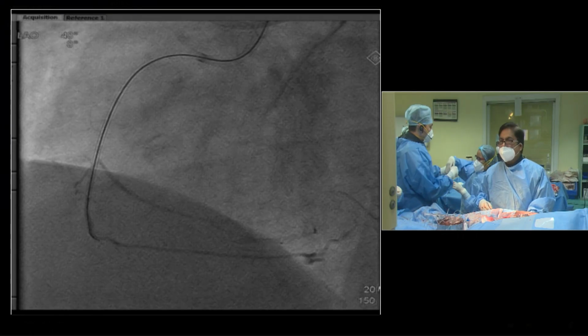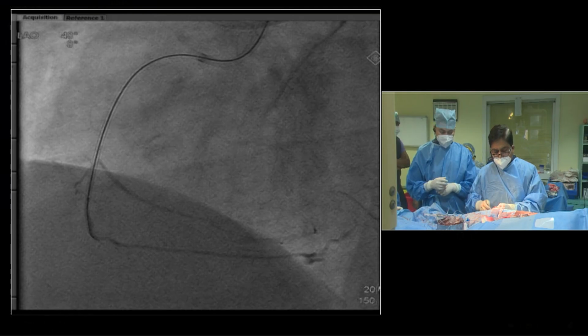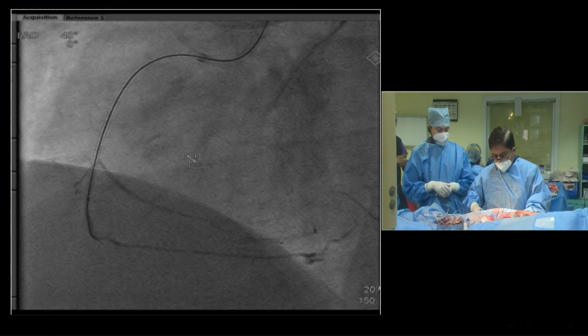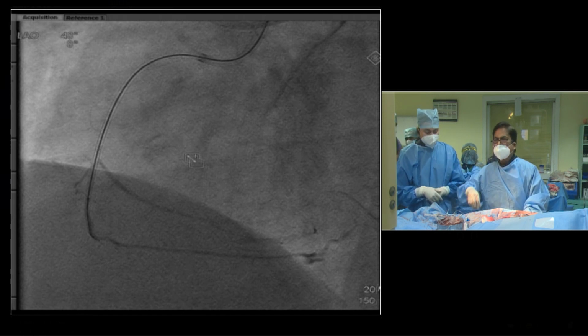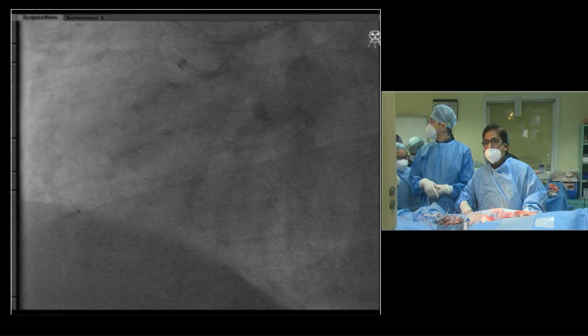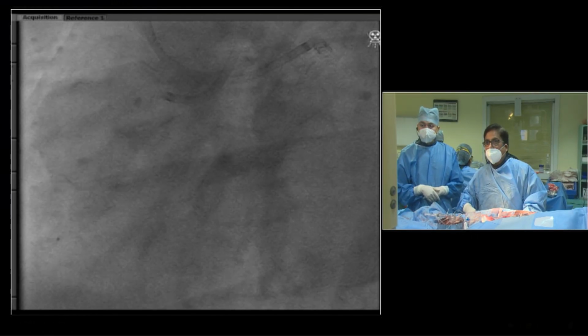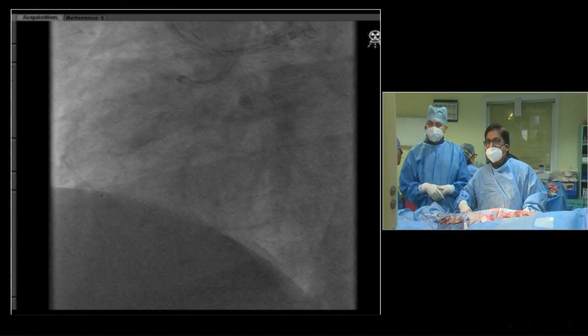So Professor Goel, just a query. You had a microcatheter in the proximal part, after you had crossed the proximal cap. And we saw that even though you had not crossed the distal cap, the catheter was advanced. So at what stage should you advance your microcatheter without being in the distal part of the vessel? Once I have some amount of wire inside, it should give support.